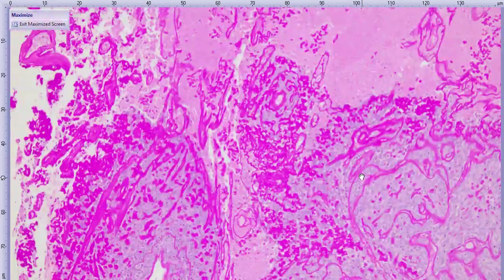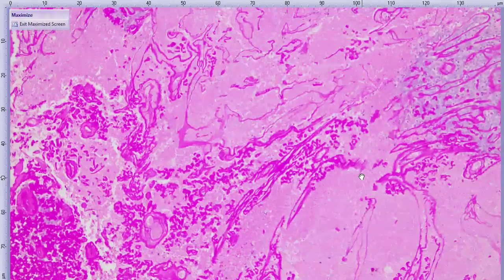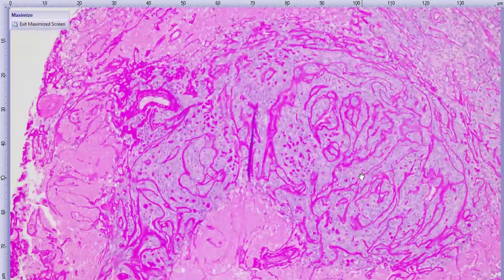Zoom. Beautiful. Look at them over here in the necrotic area. They're gorgeous. So, looking like a basement membrane deposition in this neoplasm, which is something that I haven't really seen in periocular neoplasms. So this is a really unique, kind of unusual feature for this cat.